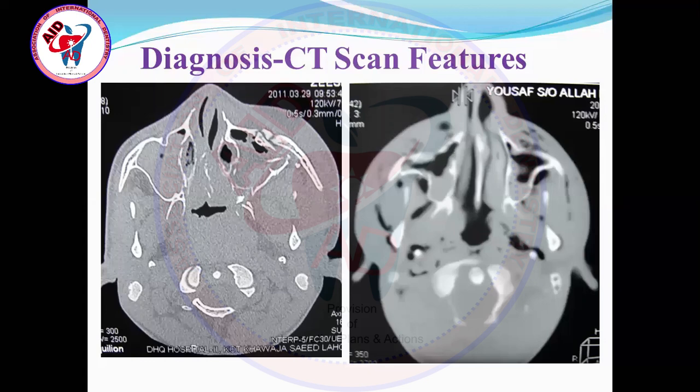The other definition could be a plane parallel to the sagittal suture, or a plane parallel to the midline, or a view similar to the lateral view. These are the three planes, and when you reconstruct these planes, we get a three-dimensional reconstruction of the face. This is just like directly visualizing the skeleton of the face on a film. We will see this in the coming slides also.